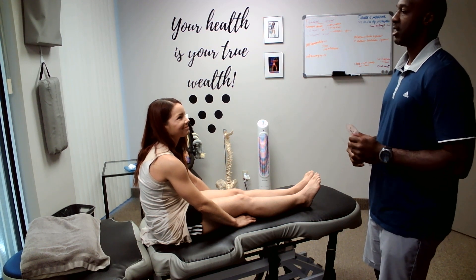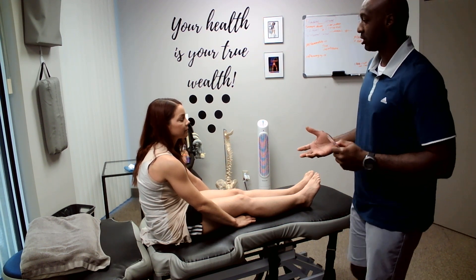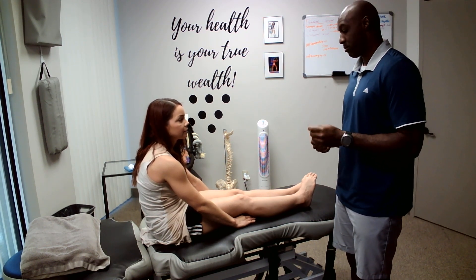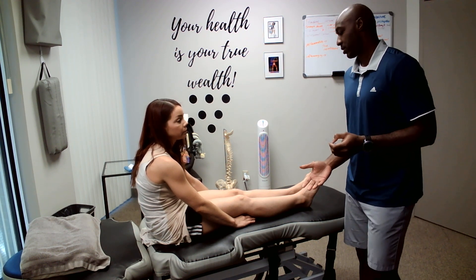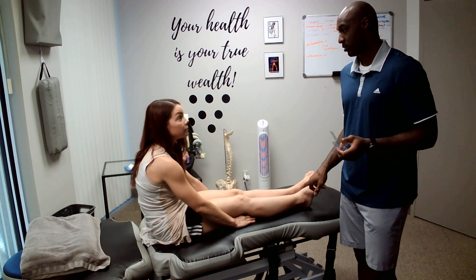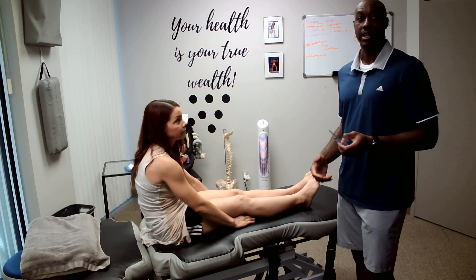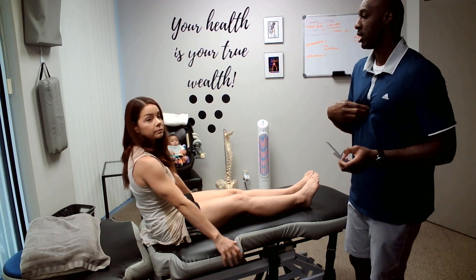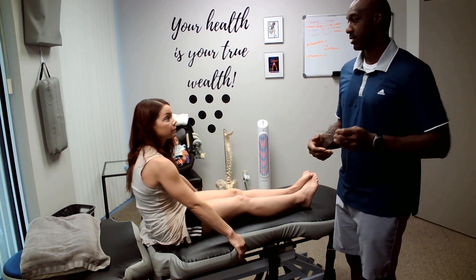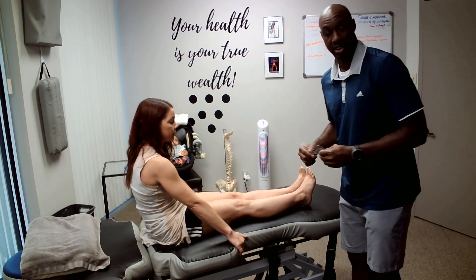I'm a student with PT at South College. Do I have consent to perform a goniometric measurement on the ankle for what's called dorsiflexion? Is that okay to confirm first for consent? And then also, is there consent to record? Because I'm using this for a PT fundamentals class to assess this.